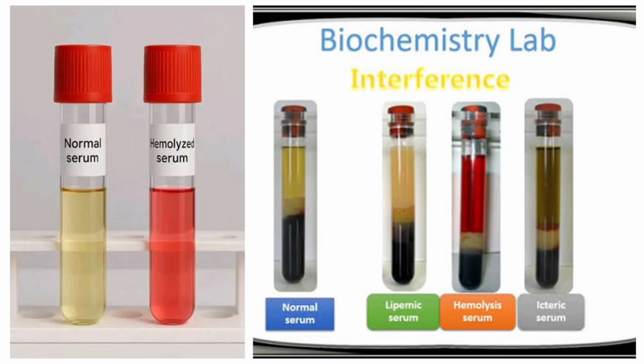So what it then means is that when we are calibrating our analyzer, generating the standard curve, generating the linearity of the analyzer, we are using something like this normal serum. You can see the normal serum now. I'm just giving you an example.